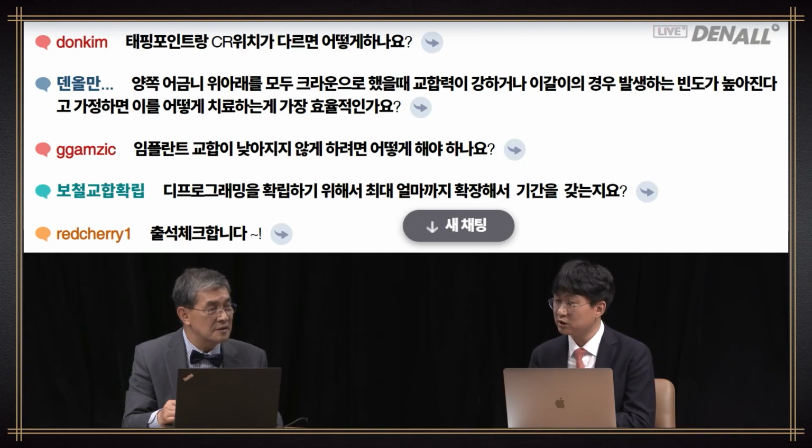Usually, the position where condyle is stable in an edentulous patient coincides with a tapping point. The tapping point and the position that we are lightly guiding would be the apex or a little bit anterior to the apex. If the positions do not coincide, it is a situation where occlusion, the current one, is unstable.